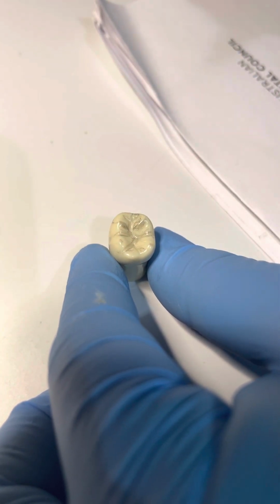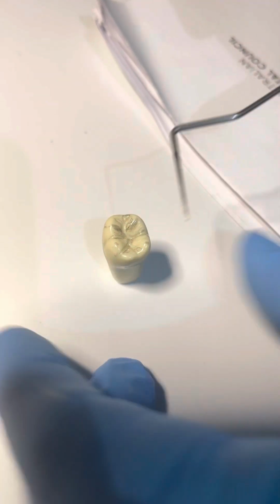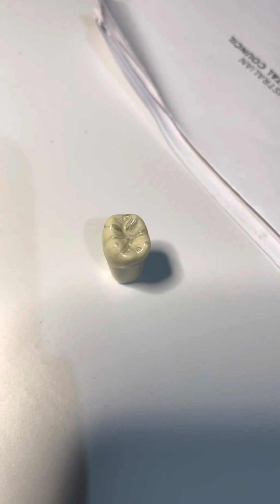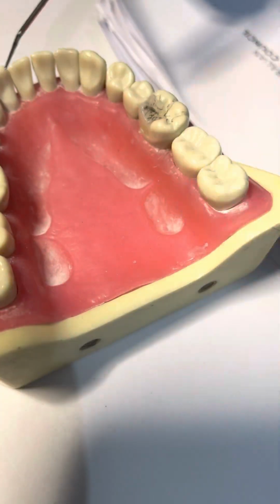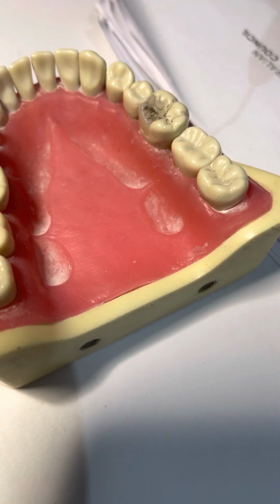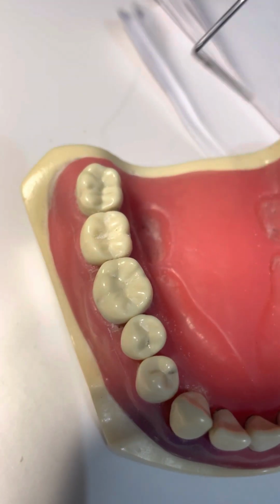So this is our cusp tip, and the other criterion is the cusp height. If you place the probe, when you look into the jaw, none of these are ideal. Give me another lower jaw.